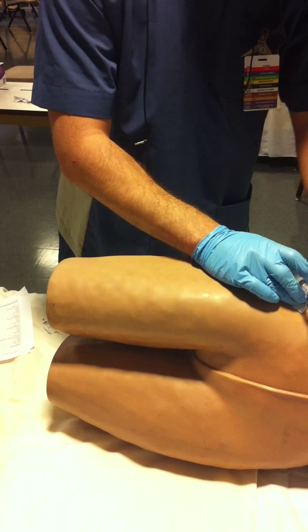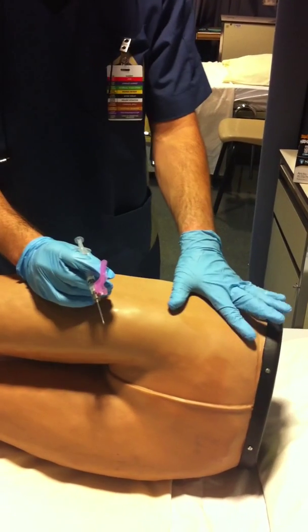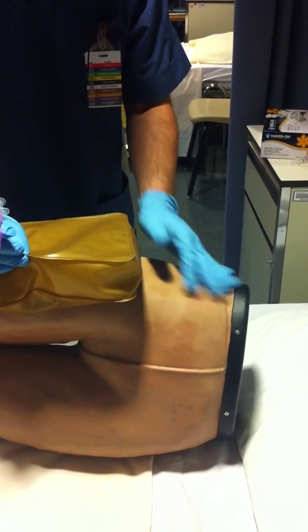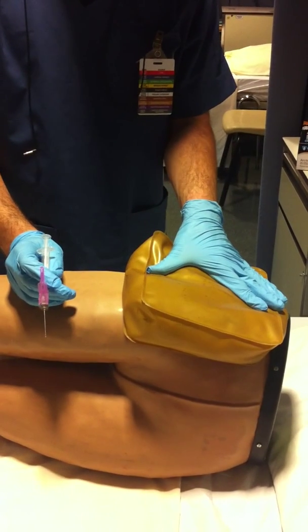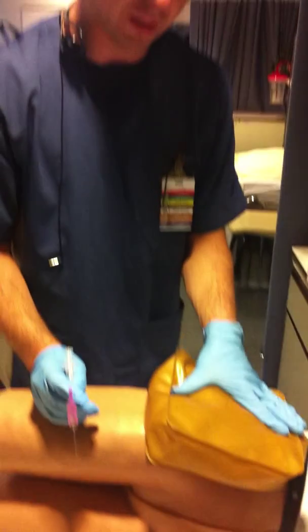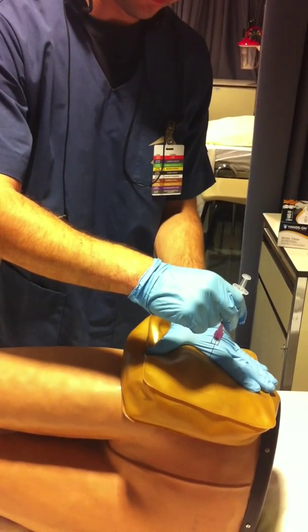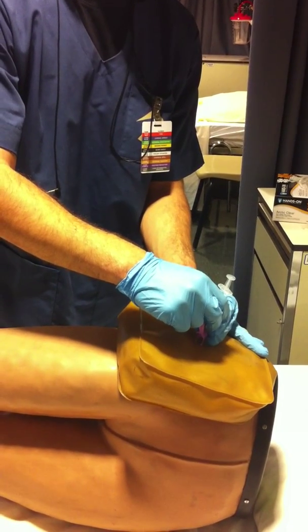Next, I'm going to get my needle prepared. Okay, now I'm going to, getting ahead of myself here. For the purposes of this demonstration, I'm going to use this injection pad here. Okay. So I'm going to stretch the skin of Mr. Tutu, make sure it's nice and tight with my non-dominant hand. With my dominant hand, I'm going to hold the syringe like a dart, and I'm going to inject it at a 90-degree angle. Then I'm going to stabilize the needle with my non-dominant hand.